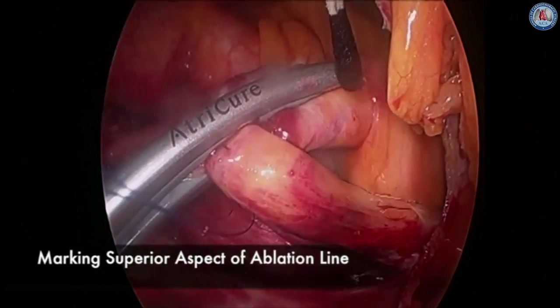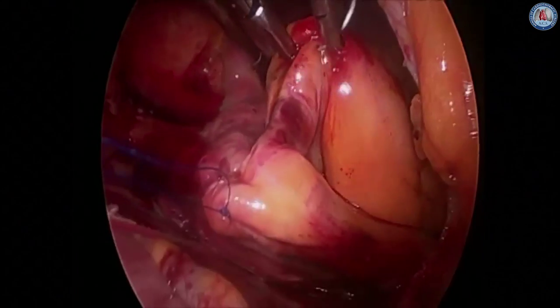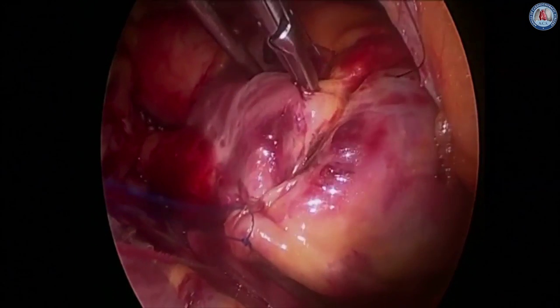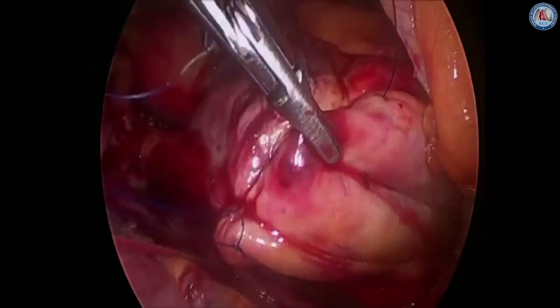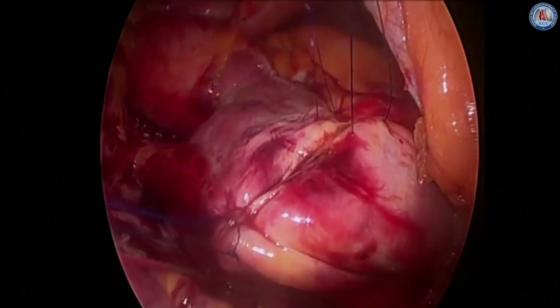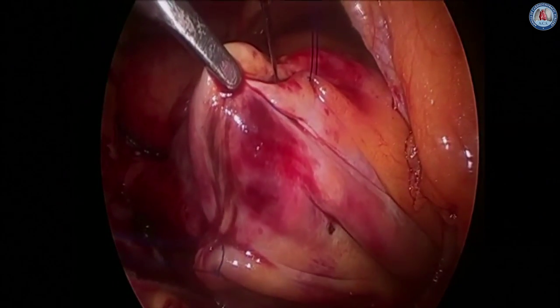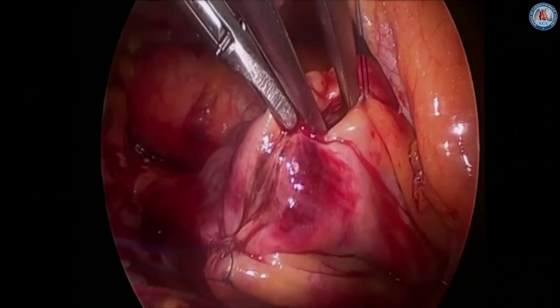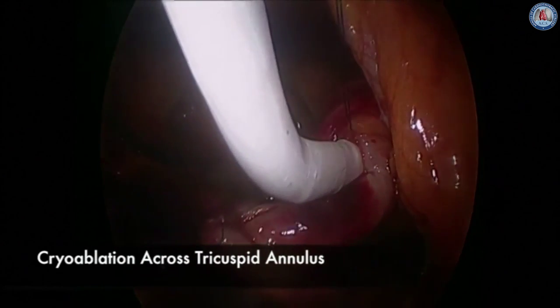The clamp should be placed up to, but not on, the AV groove fat pad to avoid any injury to the right coronary artery. The end of the ablation line is often marked with methylene blue. A second purse string suture is then placed at the superior aspect of this final ablation line. The placement of this purse string suture can be facilitated by leaving some volume on the heart-lung machine. Once this purse string suture is placed, an 11 blade is used to make a puncture wound, which is dilated with a tonsil clamp.